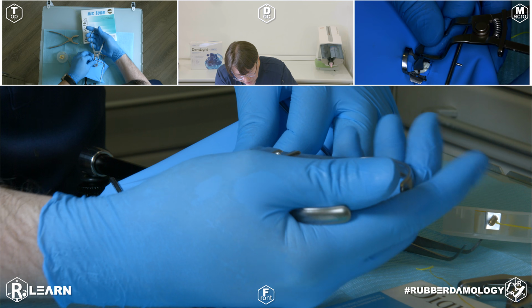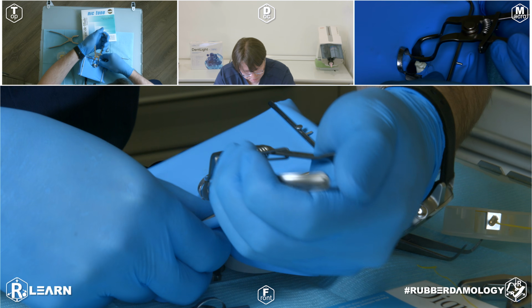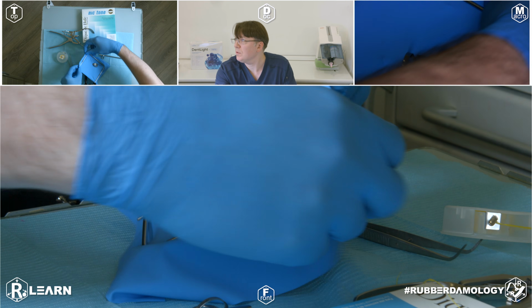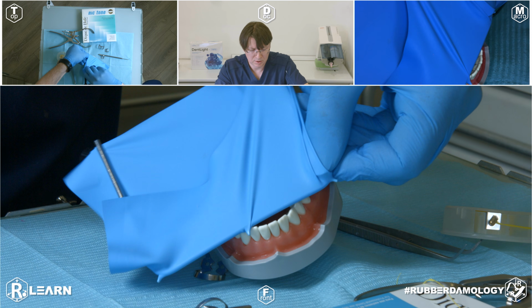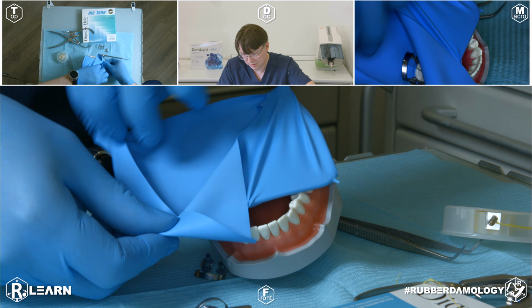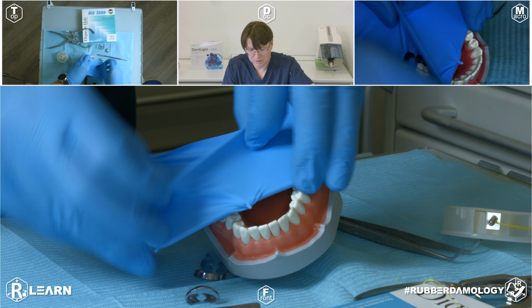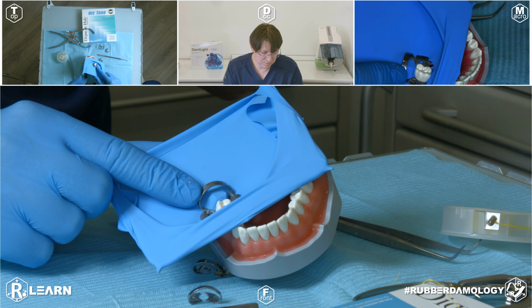Sometimes you need correction, no problem. And when you finish your exercise, don't forget to make an envelope on your free rubber dam margin of your rubber dam plate. That's all, your exercise is finished. Try it by yourself.